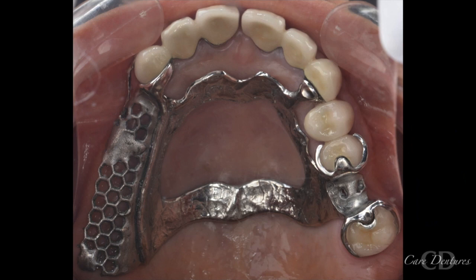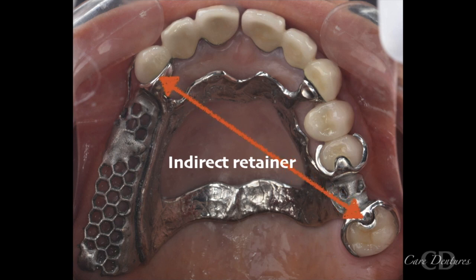So the rest seats are not just a part of the main abutment tooth. Indirect retainers, which are placed away from direct retainers at secondary sites, also bear a rest. Typically, canines are utilized for this purpose and have a rest on their cingula. A reliable landmark on the palatal surface is the cingulum. Indirect retainers may sometimes be devoid of a retentive element but would definitely bear an auxiliary rest.